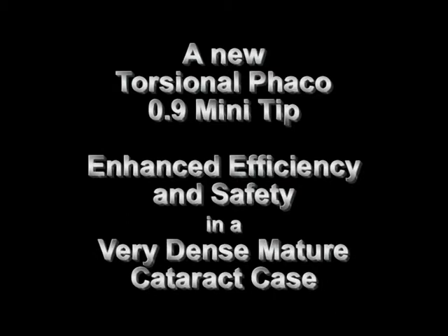This video clip demonstrates the new Torsional Phaco 0.9 mini tip, showing enhanced efficiency and safety in a very dense, mature cataract case.